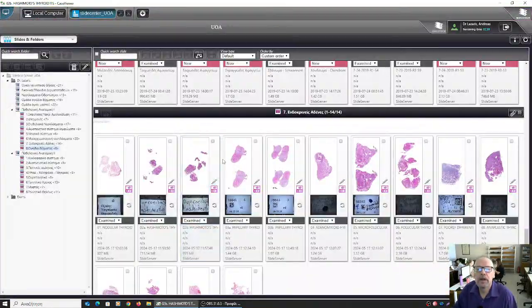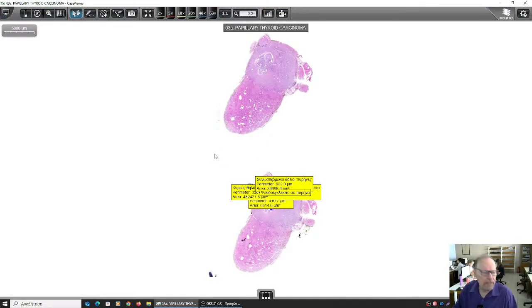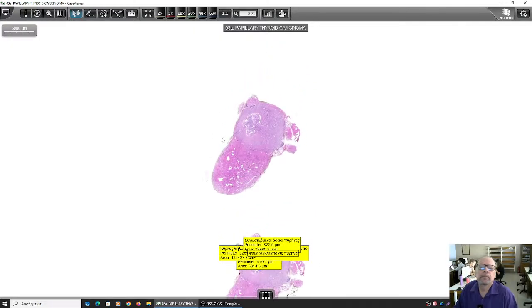Very good. Now, let's check the commonest malignant neoplasm of the thyroid, which is often incidentally diagnosed either from its rise in the thyroid or from its regional lymph nodal metastasis, which however does not worsen survival.